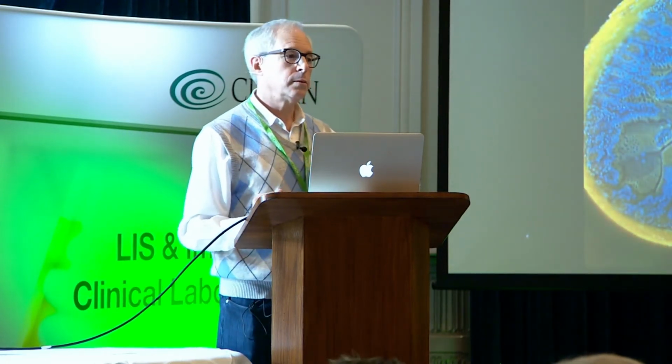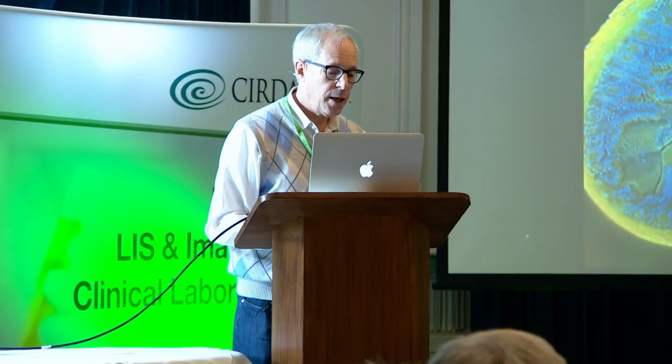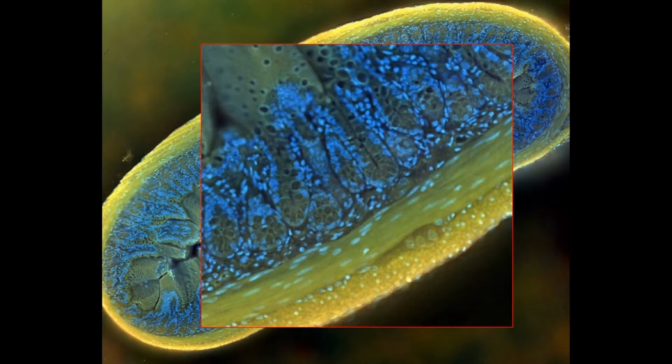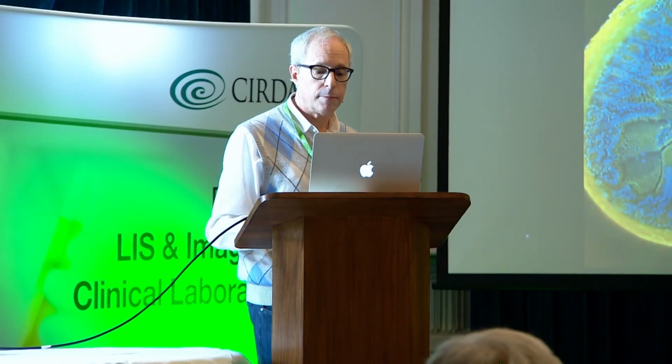So here's another challenge. What is this? Well, it's not what I thought. It's not a mitochondrion, because that's the wrong size. This is a mouse small bowel, ileum, I think, and it's really rather pretty. If you zoom in, you can see the two different muscle layers and a nerve ganglion right here. We've started to use this to look for ganglion problems in Hirschsprung's disease very rapidly. It turns out one of our stains highlights the ganglion cells rather dramatically.